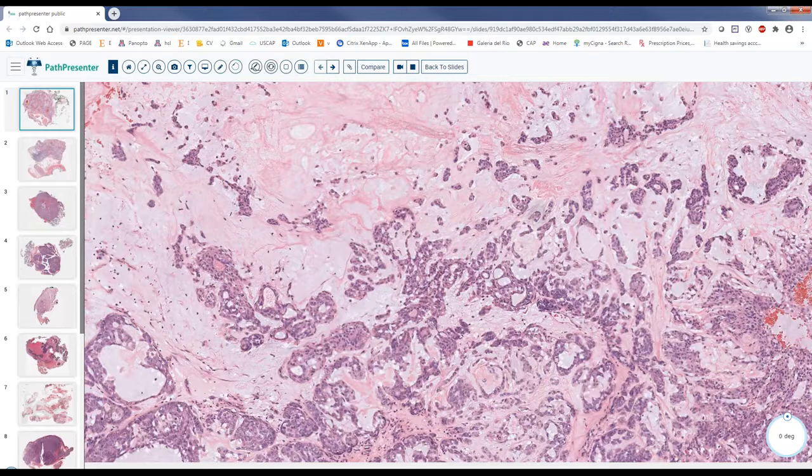What is the nature of this tumor? What is the component of this tumor? I'll look into the chat area. Well, I see mixed. I agree with that. Do you have a fancier word for it? Well, I like kind of biphasic.